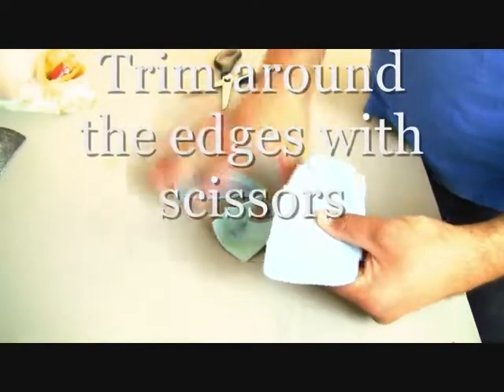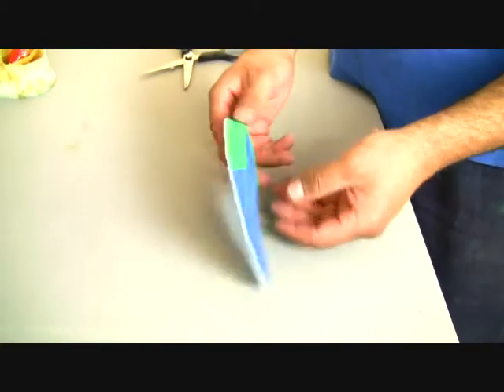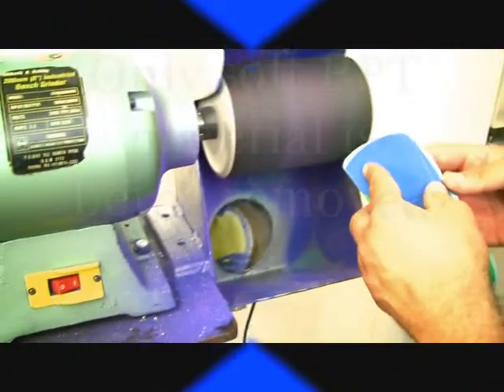Trim the PPT cover with scissors, leaving a skirt of about 1 to 2 millimeters around the entire edge of the orthotic. A bench grinder will give you the best and cleanest edge. Only remove the PPT material and keep your hands soft as you grind.